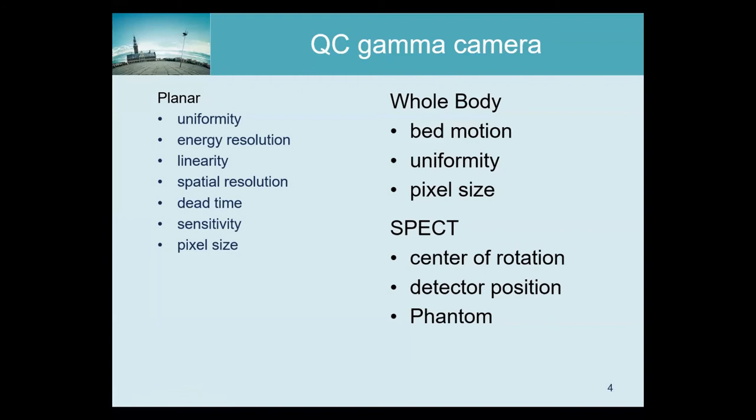And so normally it's a continuous motion, which is more comfortable for the patient, and the whole thing is acquired in one big image. But of course, that requires that that bed motion is perfectly operated as it should, such that the relation between pixel size and motion of the bed is correct. Because the patient is moved, that moves what is acquired to a different position in the global acquisition image. So if there is anything wrong with the speed of the bed, then there will be a deformation of that image. Again, in the past, this was important. For this to happen now is very unlikely.